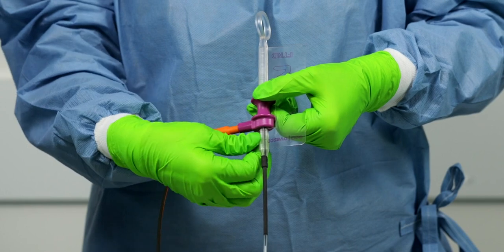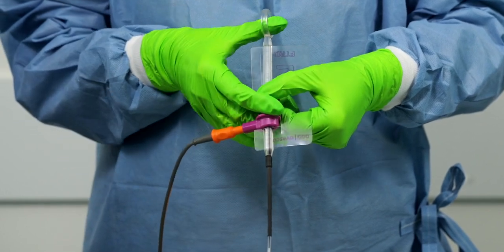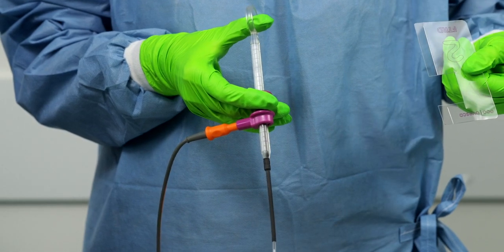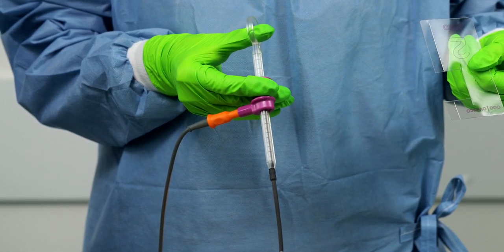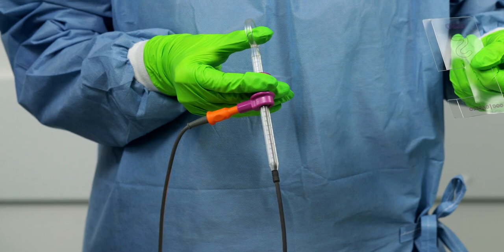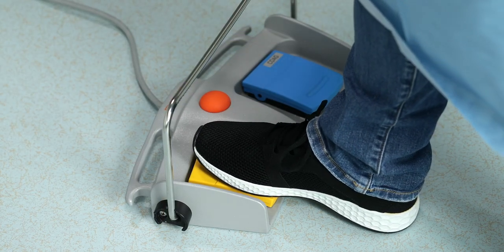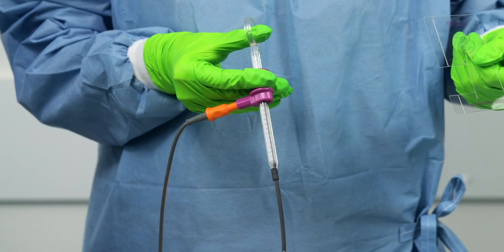After the clip has been applied, give the command to release the snare safety lock. Pull the sliding handle backwards until resistance is reached and hold it in this position. Activate the HF current for the final resection after the snare is securely closed around the tissue.